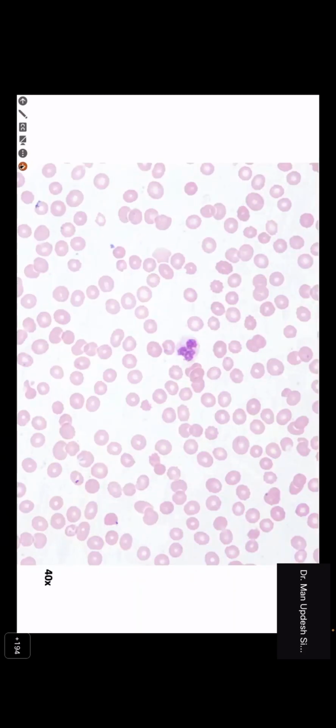I think it's just the lower density of RBCs again. We can possibly go on the morphology in the next slide. So here I think you can comment on RBC morphology. Yes, Dr. Tanushri, the slide is not visible yet. Yes, sir. Can see. Okay.